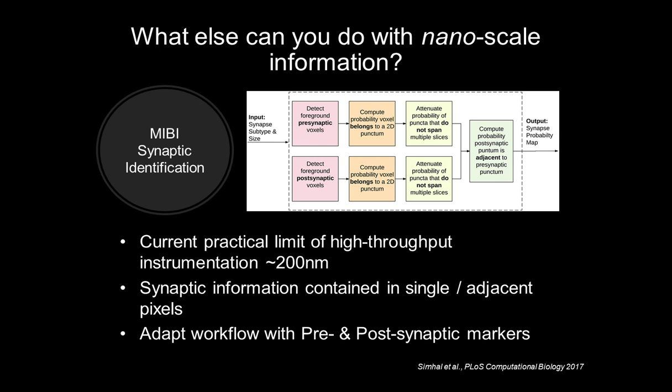With the brain, as you saw from a lot of these images, while you can see nuclei and individual cells, a lot of the brain is not necessarily extracellular tissue, but only parts of cells, because some of the cells are quite large and exist across multiple planes in the brain. So instead of just extracting cells, which I think is important, we are also starting to think about what other features we extract.